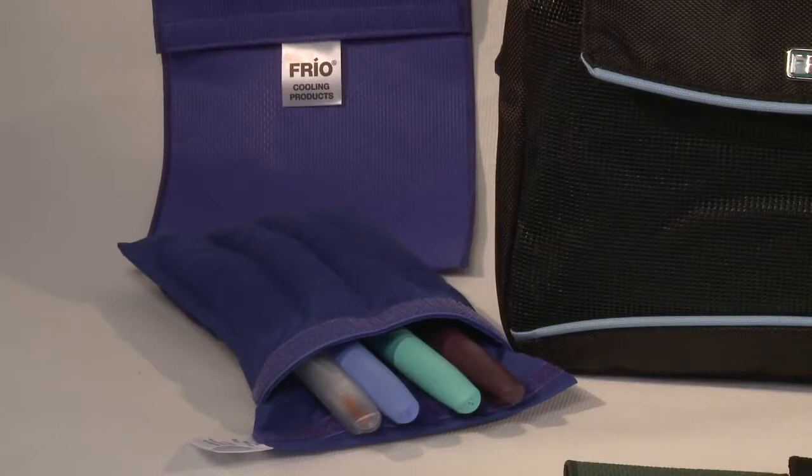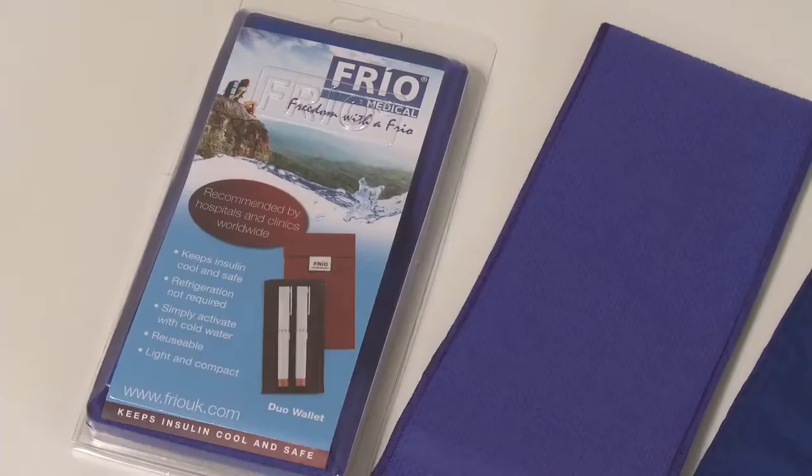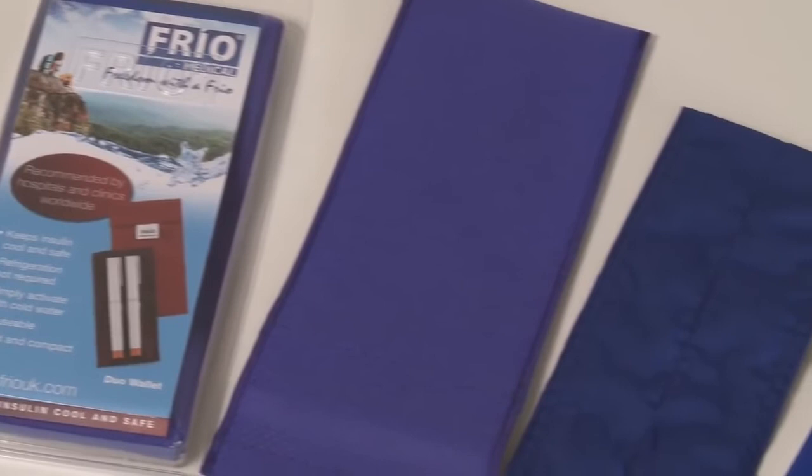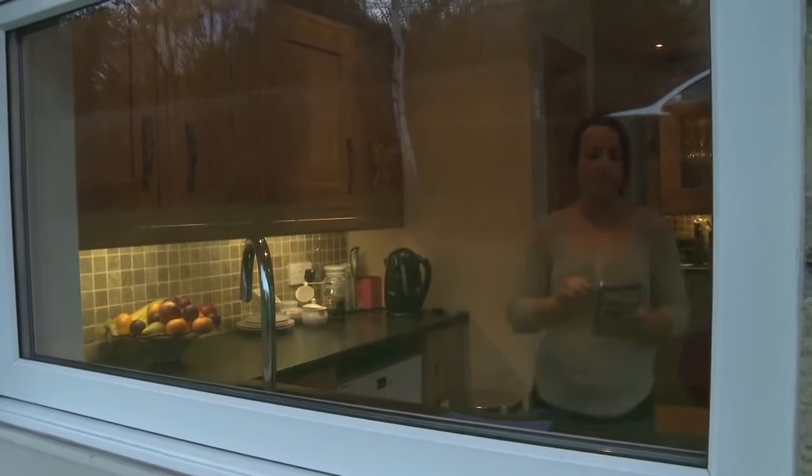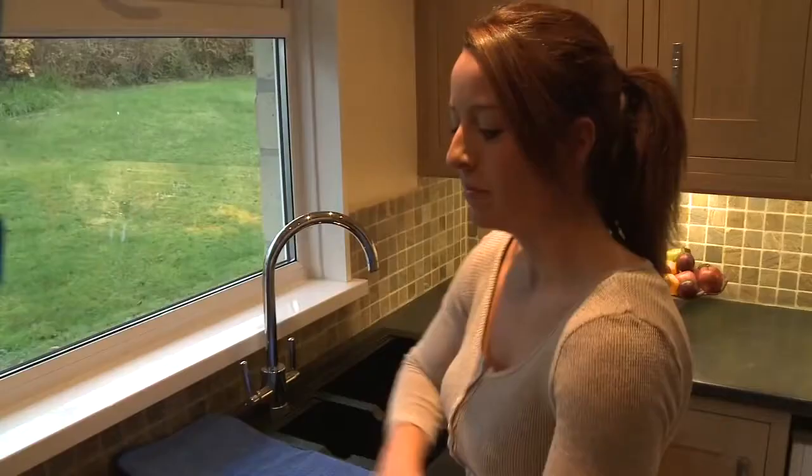This is the Frio Insulin and Medication Cooling Wallet. You're about to watch a simple demonstration of its activation and use. To activate the Frio Wallet, you'll need access to water. Firstly, remove the wallet from its packaging. The Frio comes with an inner wallet and an outer cover.